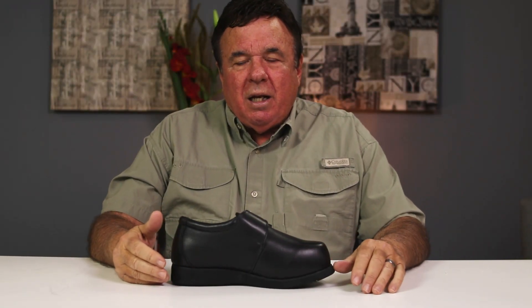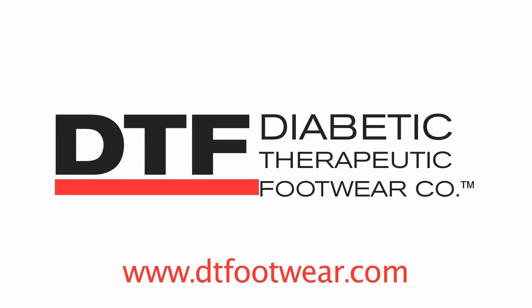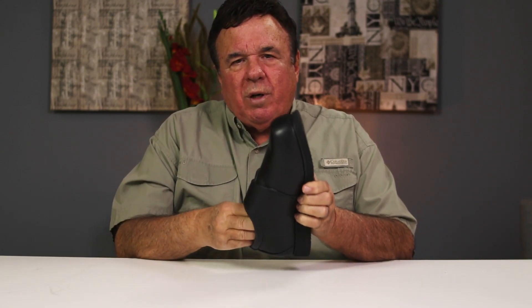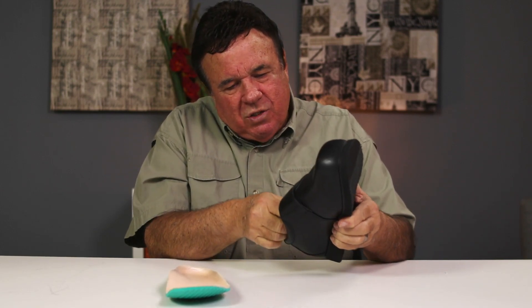Hi, I'm Ron Heinlein and I'm the president and owner of DTF Company. I want to introduce you to one of our styles, but first I want to take the insert that's in it, see if there's any spacers in it — and there happen to be two of them — and we'll talk about this in just a few minutes.